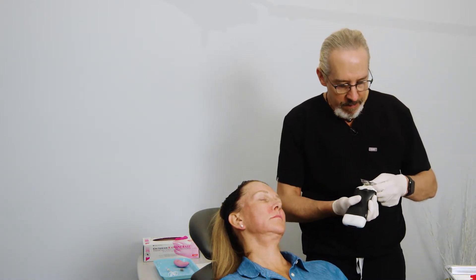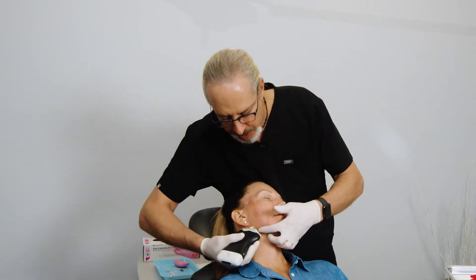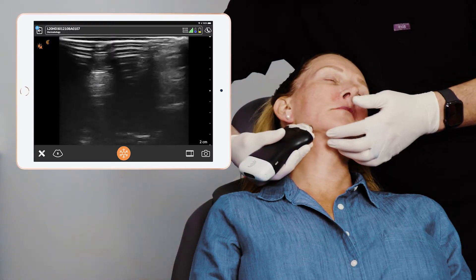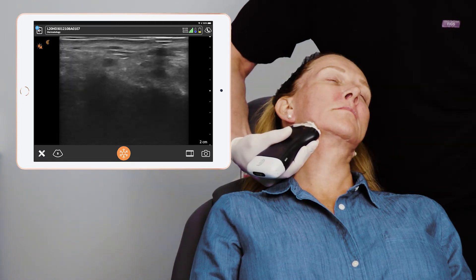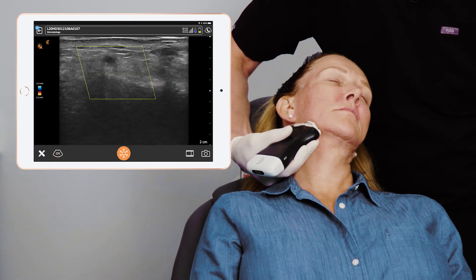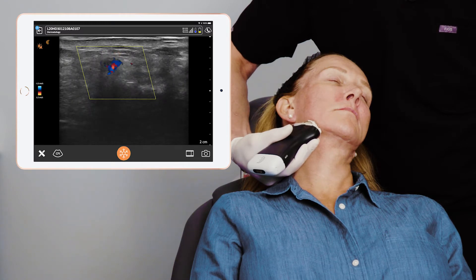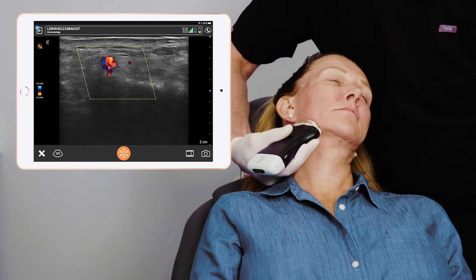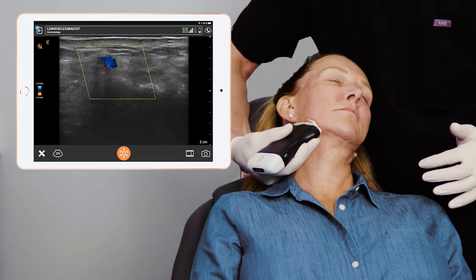We're going to use the sterile ultrasound gel and go into the antagonial notch, which I can feel right here, and I'm just going to confirm the arteries. We can actually see them in B mode, and I'm going to change it over to color. There's the artery right there - so the artery is right here and we need to inject posterior to that.